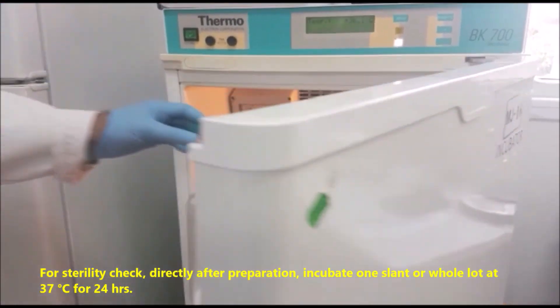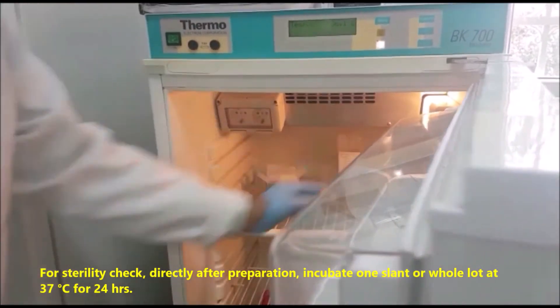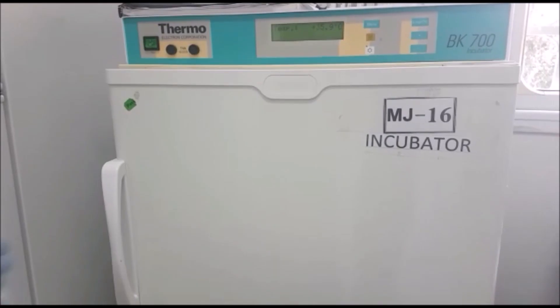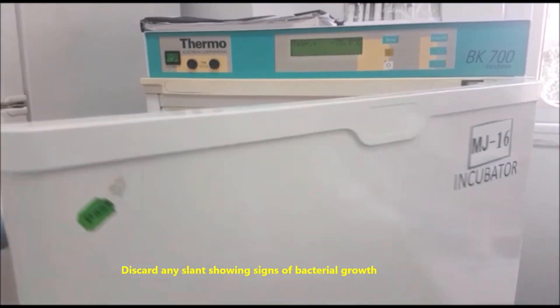For sterility check, directly after preparation, incubate one slant or the whole lot at 37 degrees centigrade for 24 hours. Discard any slant showing signs of bacterial growth.